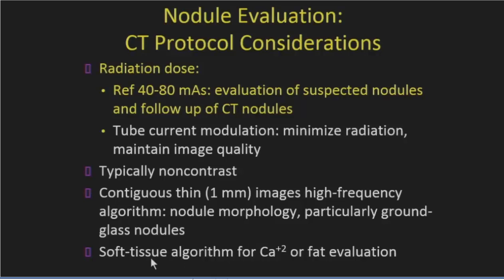A soft tissue algorithm is something that, if we suspect fat is present in the lesion, we have these series reconstructed in thin sections to see and better assess with more confidence for the presence of fat.